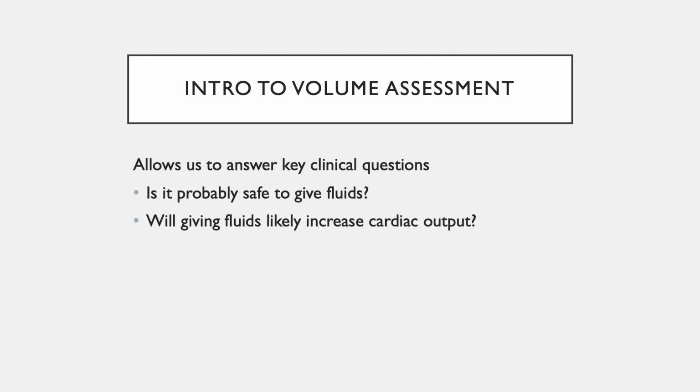Second, we can try to answer whether or not fluids would increase the cardiac output and help to optimize our cardiovascular dynamics. Lastly, we should try to answer whether or not there is organ congestion, and in turn, whether diuretics would be more beneficial for a particular patient.